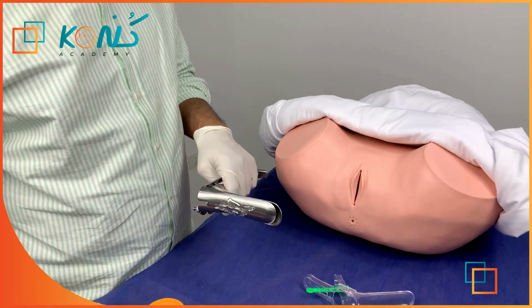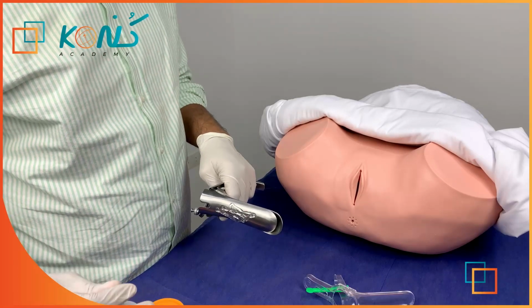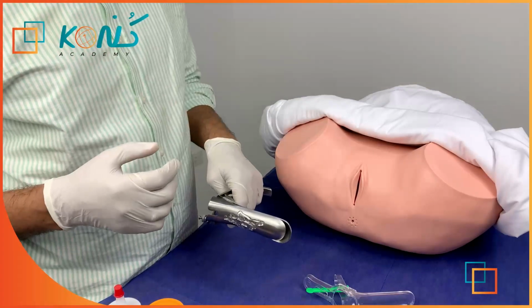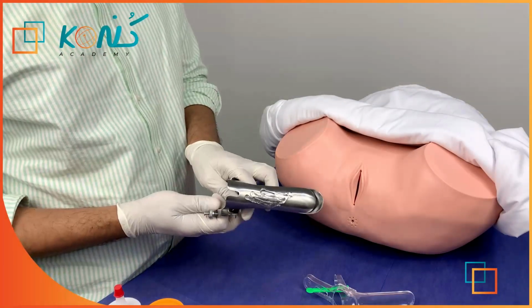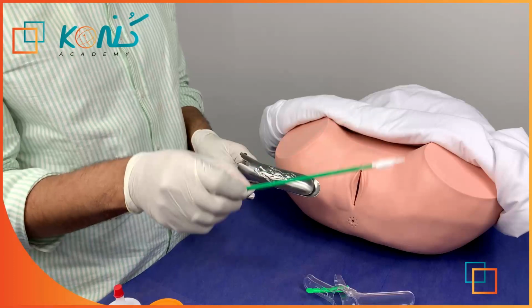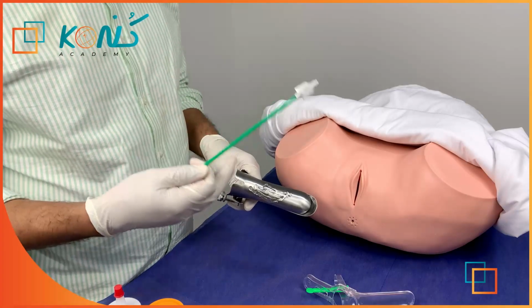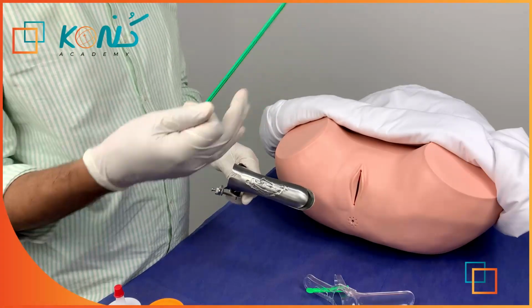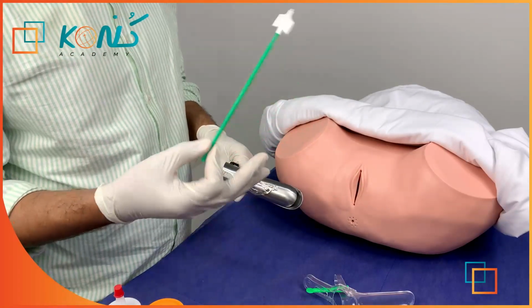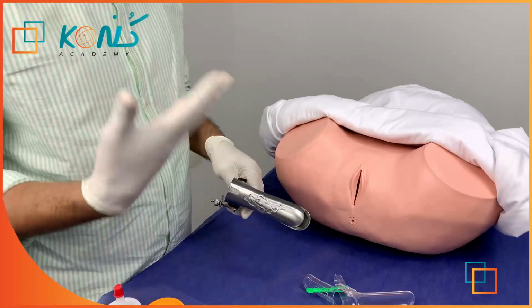If you want to further explain the detailed cervical screening to your patient while you are explaining the procedure, it will be all right. I would simply explain to her, I will have a look around the private area and I will insert this device called the speculum to have a look around the cervical canal, and we will insert this brush also to take a sample from your cervical canal to examine it under microscopy, as we are trying to find out if there is any HPV virus there, which is responsible for cervical cancer, and also if there are any abnormal cells in the cytology or not. If you want to explain these first details to your patient before starting, it will be all right.